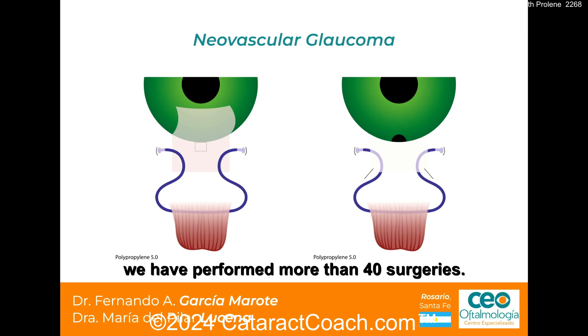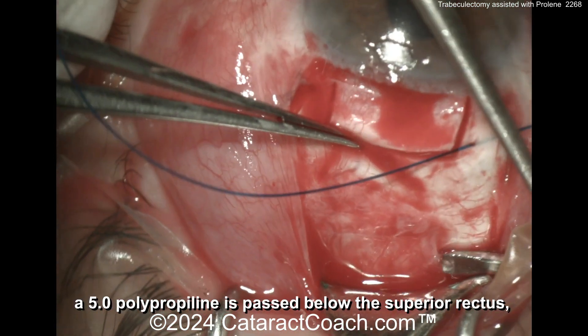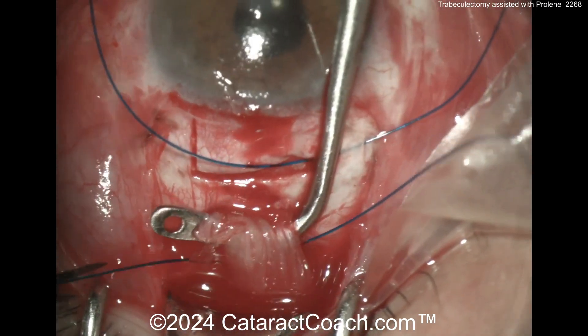In the last two years they have more than 40 surgeries, and they modified the technique for the treatment of neovascular glaucoma in order to divert angiogenesis factors to the posterior sub-Tenon's space. In this one, there's the 5-0 proline — it's passed like the others, but then it goes behind the superior rectus muscle.